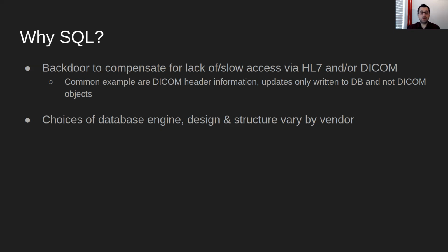If you wanted to retrieve a cohort of patients via DICOM DIMSE, that also may not be the easiest task. Even though you can do it on demand, it still is a lot of back and forth, and you're going to run into nuances with concurrency and bandwidth and things like that. So a lot of times, SQL is a backdoor that allows you easier access to your data. If you want to round up a list of patients or studies between certain dates, you can just run a query and get that information super easily, super quickly.